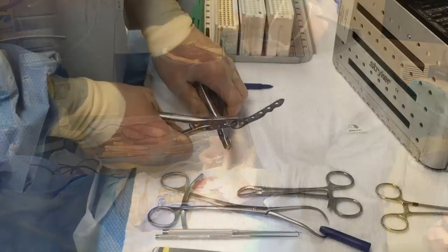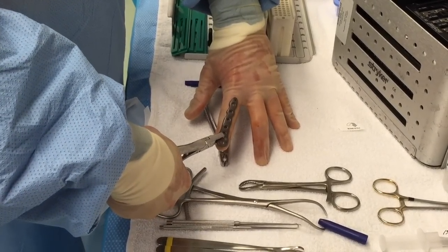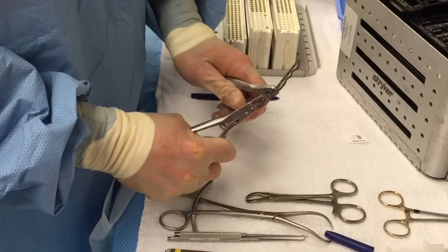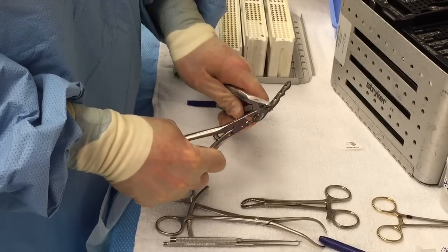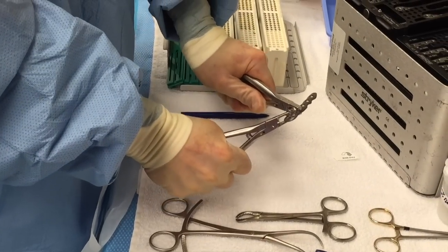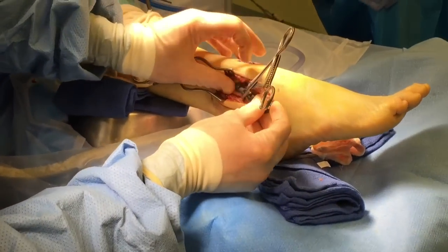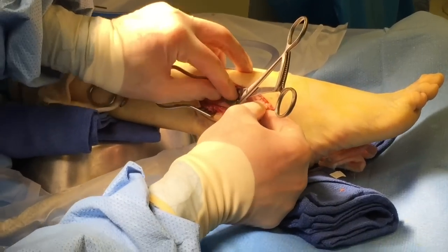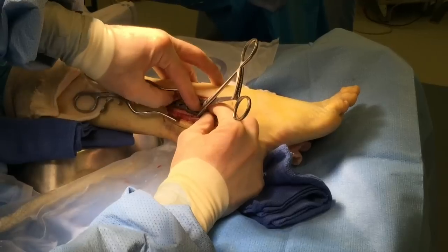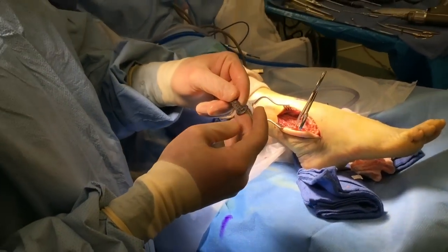Now what we found is this plate, if this is the fibula — my finger right here — the plate is a little bit up and rotated, so I'm going to take the end here and teardrop it down and inwards. I'll put it on the fibula to show you how well it conforms. With these bending tools, they go right through the holes which is great so you're not marring up the surface. I'm just going to tweak it downwards a little bit and give it some back pressure. It should slip right in and fit on top of the fibula nicely. It's teardropping down nicely at the distal fibula, and we'll fuss with it until it's perfect.